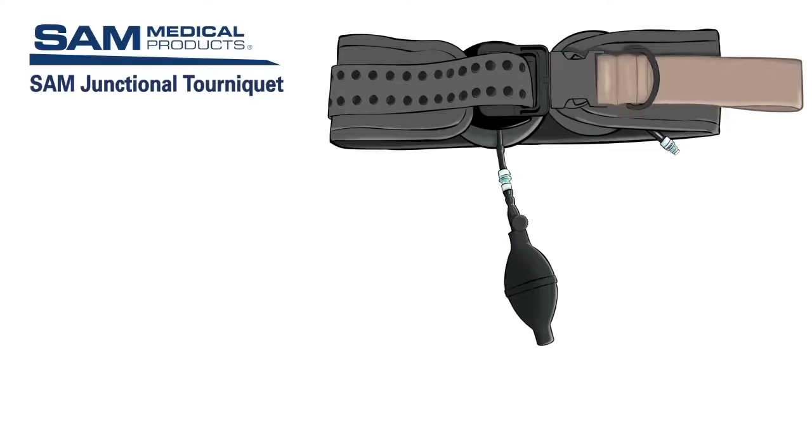The main components of the SAM Junctional Tourniquet include the belt, buckle, target compression device, or TCD, and the hand pump.